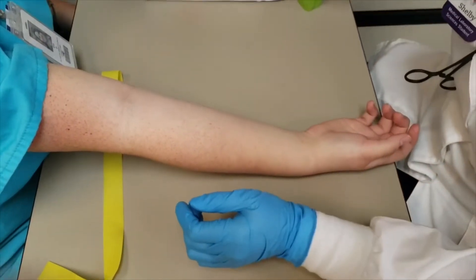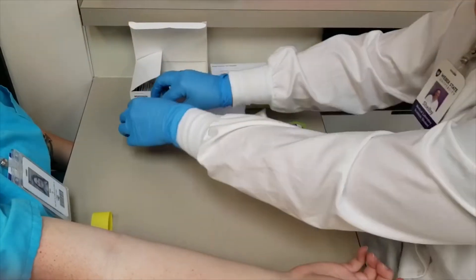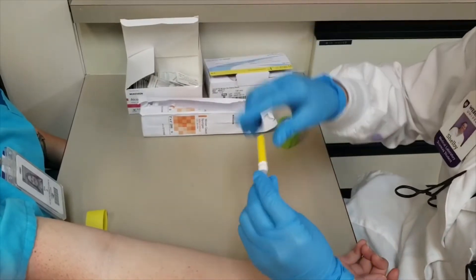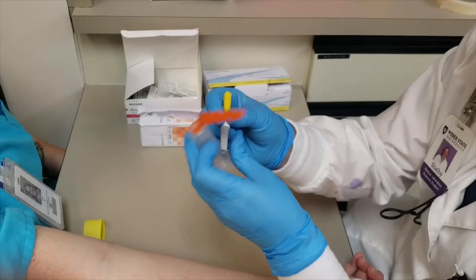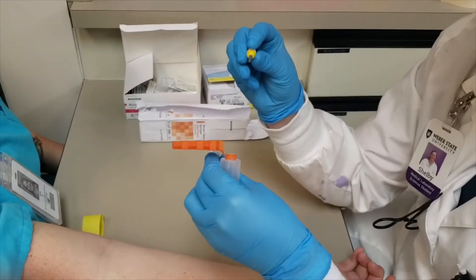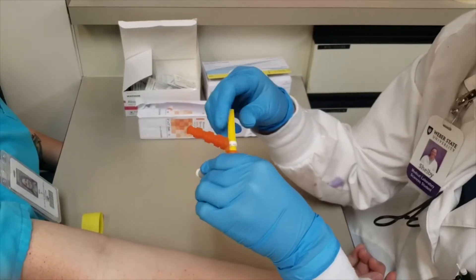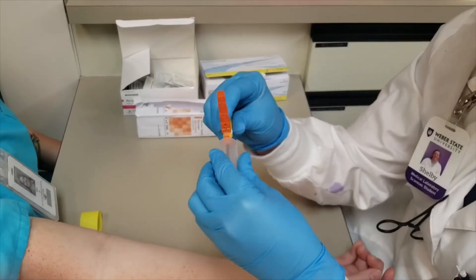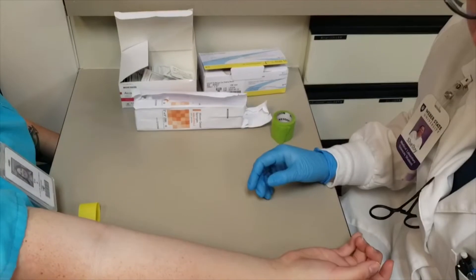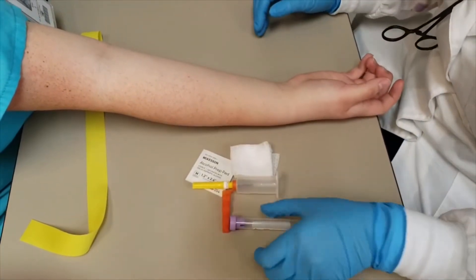First you're going to get your alcohol swab out. Then you're going to grab some gauze. Then you're going to grab your needle and then the hub. You take this gray part off, and you have to be careful because there's still a needle underneath the gray. Then you twist it into your hub and make sure it's nice and tight — you don't want the needle to come out when you're sticking someone. Grab your tubes, make sure you have them in order and they're out and ready.